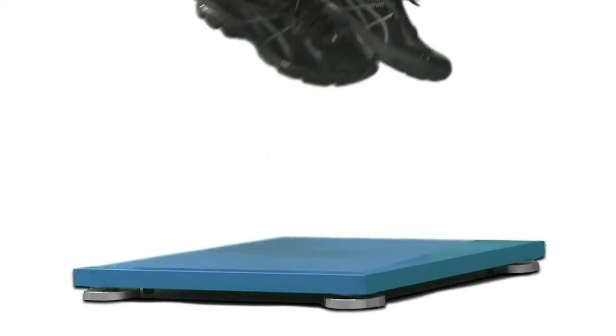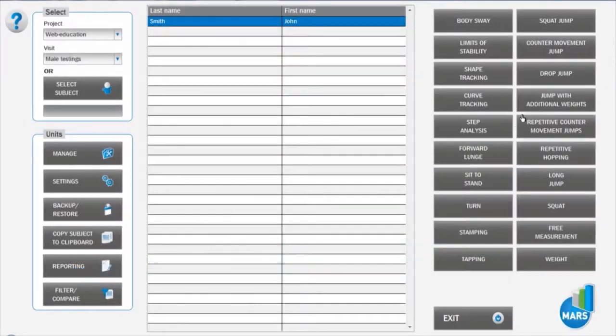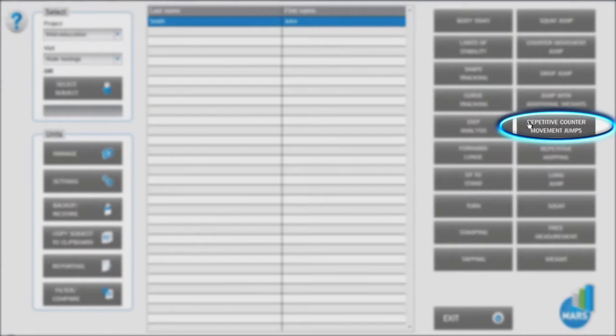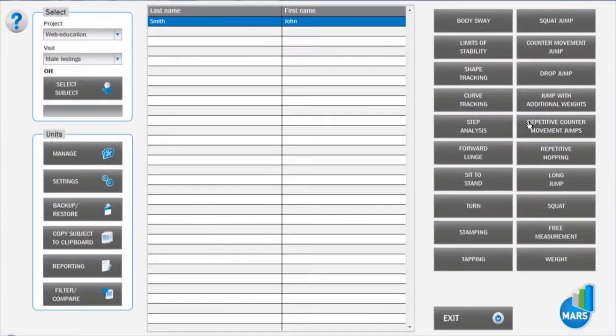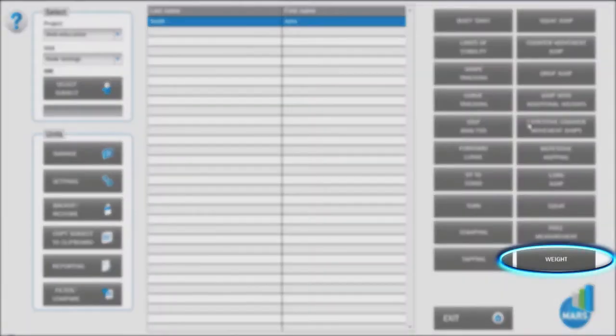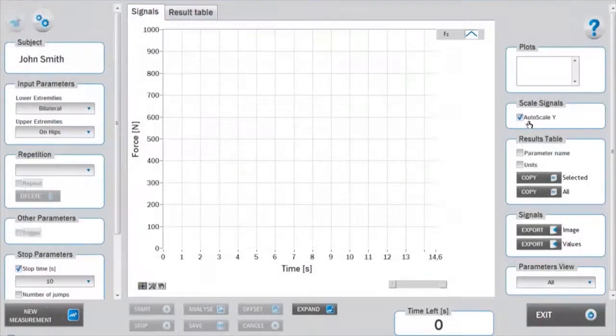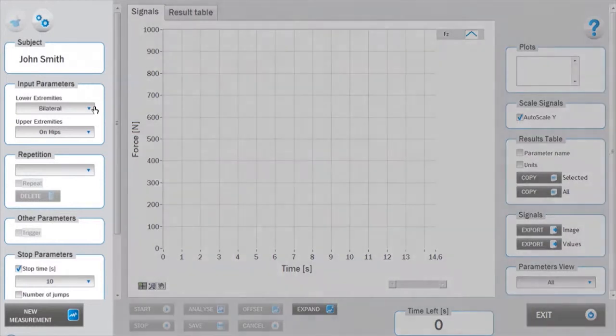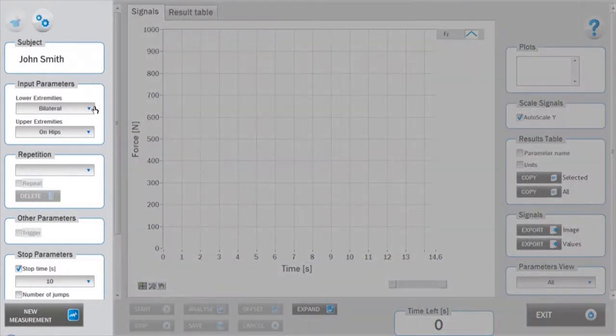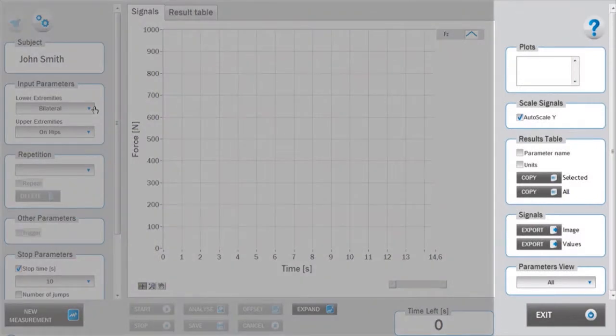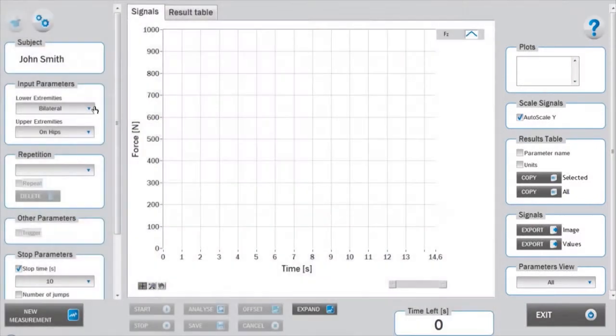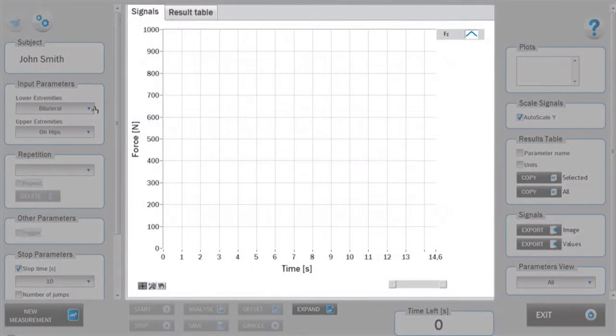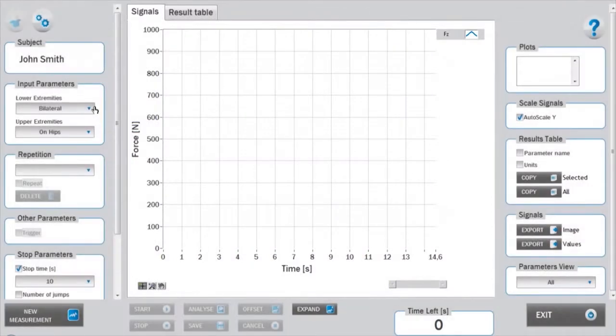Enter the repetitive counter-movement jump test module from the main window by clicking on the repetitive counter-movement jump icon. Make sure you have acquired the subject's body weight beforehand. As with all Mars test modules, the interface is divided into a left setup panel, right analysis panel, bottom measurement panel, and central signals and results area. Before starting the measurement, appropriate input parameters must be determined in the setup panel.